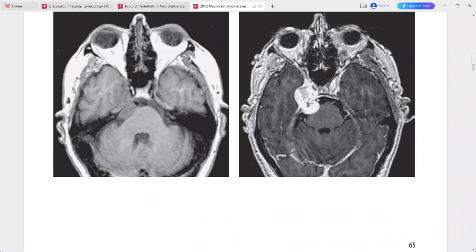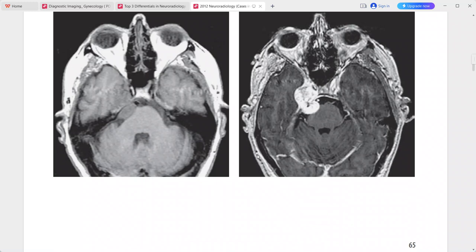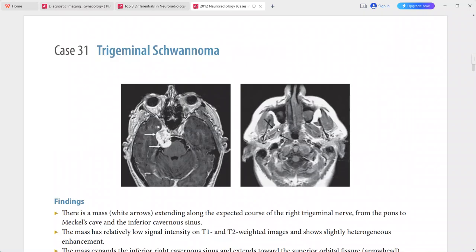The mass is expanding the right inferior cavernous sinus and extending towards the right superior orbital fissure, with slightly heterogeneous enhancement on post-contrast sequences. There is relative atrophy of the right pterygoid muscles compared to the left. This is a case of trigeminal schwannoma. Differentials include meningioma, metastasis, perineural tumor spread, and chondrosarcoma.